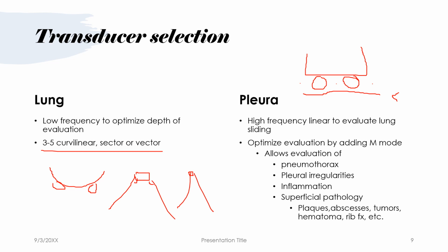And again, you would see this would be the parietal pleura. You should have another level of the visceral pleura. That visceral pleura is going to be so thin, you're not going to be able to determine which one is which. The only indicator you have, again, is that movement of the visceral pleura. So you have to see that movement to know that that lung is fully expanded.